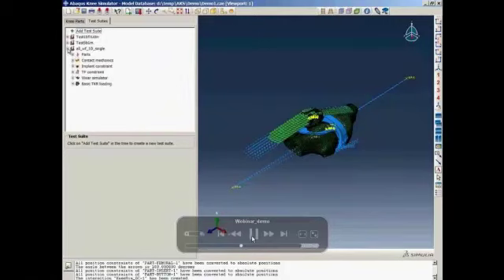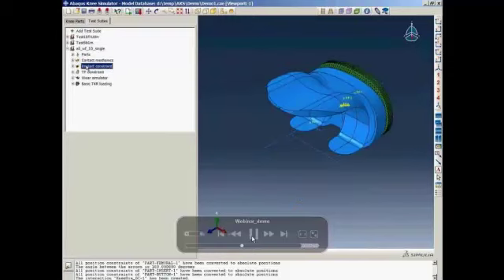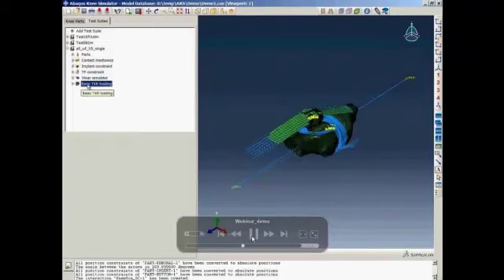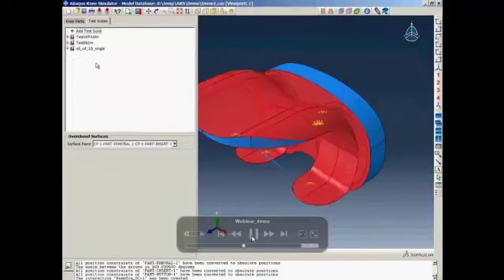Now we have the workflow generated. The user can go ahead and review each workflow. Tibial-femoral constraint, wear simulator, total knee replacement. All the workflow models have been generated. And next, by right-clicking on the workflow, the user can access the interference check. Now, because there is interference between the two components I imported, they are highlighted.